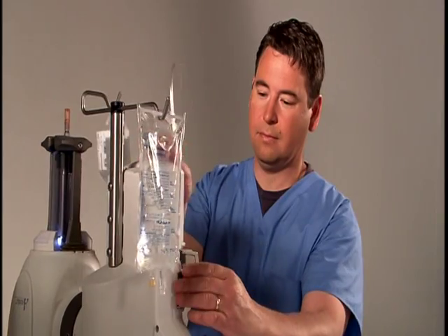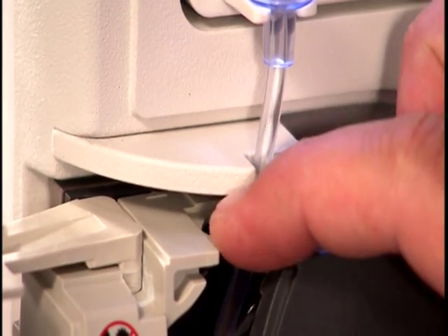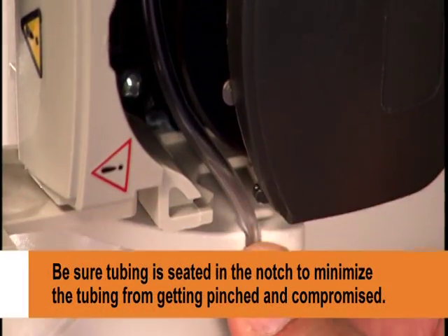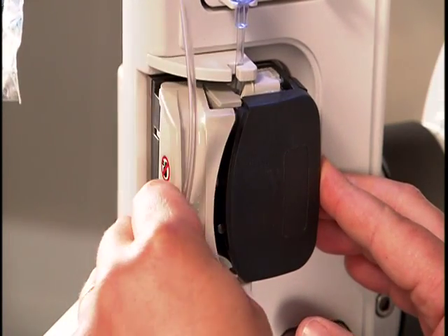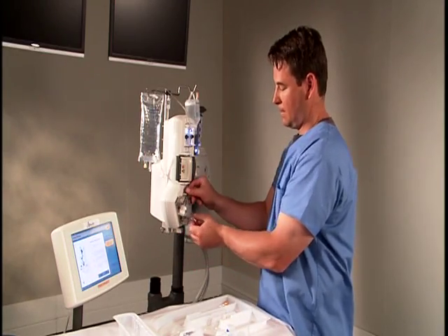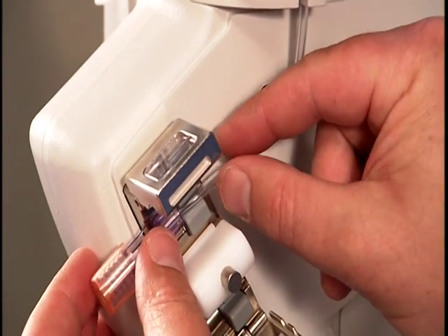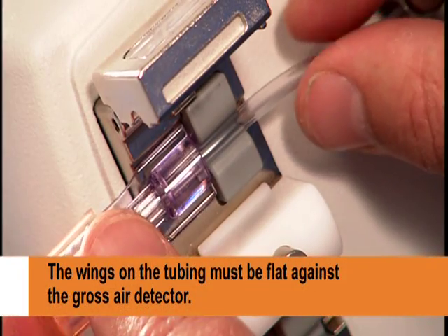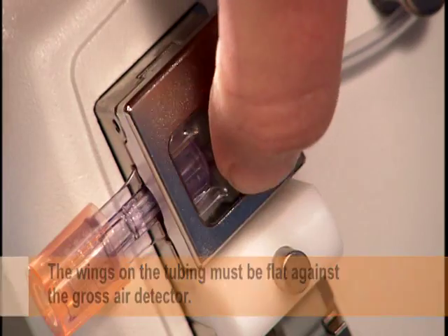Step 2. Open the peristaltic pump door. Route the tubing through the pump. To minimize pinching, make sure the tubing is seated in the notches, then close the pump door. Step 3. Route the tubing around the peg. Step 4. Insert the tubing connector into the gross air detector. Make sure that the wings on the tubing connector are flat against the air detector, then close the door.